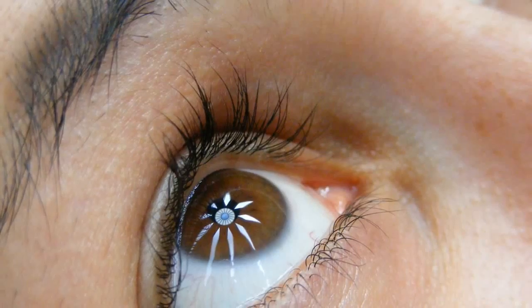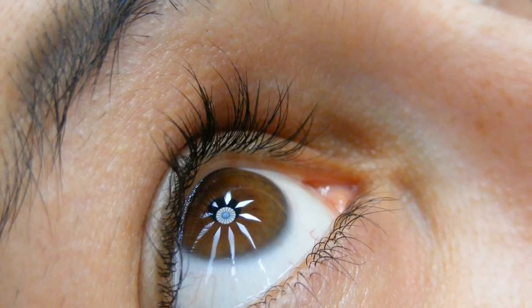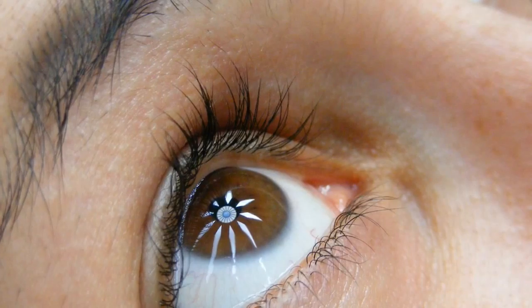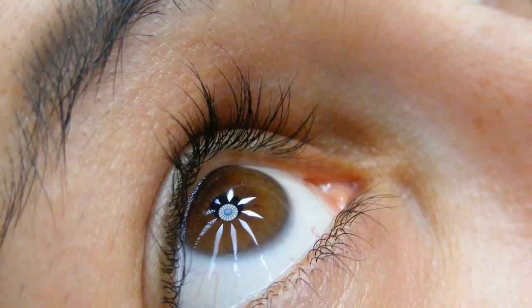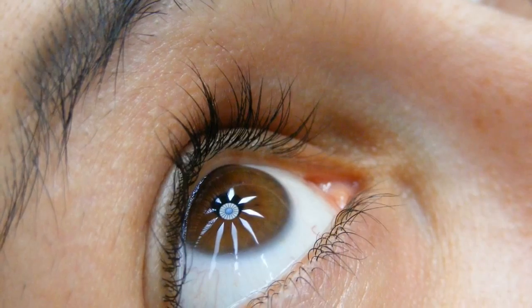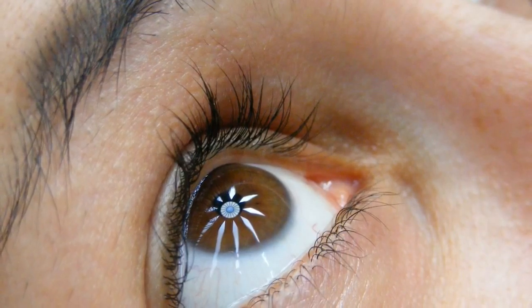The first lens implant to offer widescreen vision is set to transform the lives of millions of Britons suffering a debilitating eye condition. Age-related macular degeneration, AMD, is the leading cause of sight loss in the over 55s.